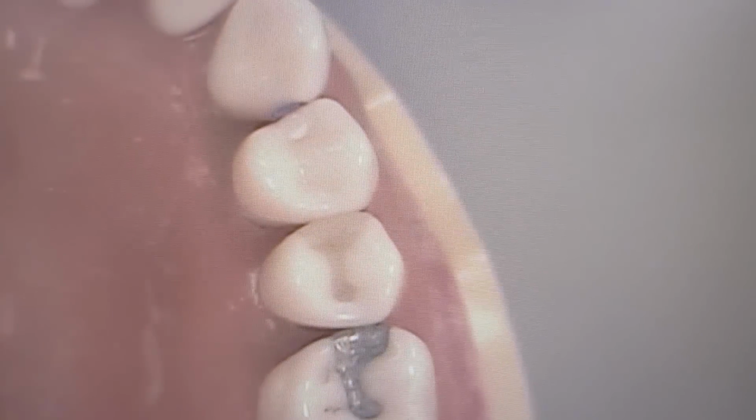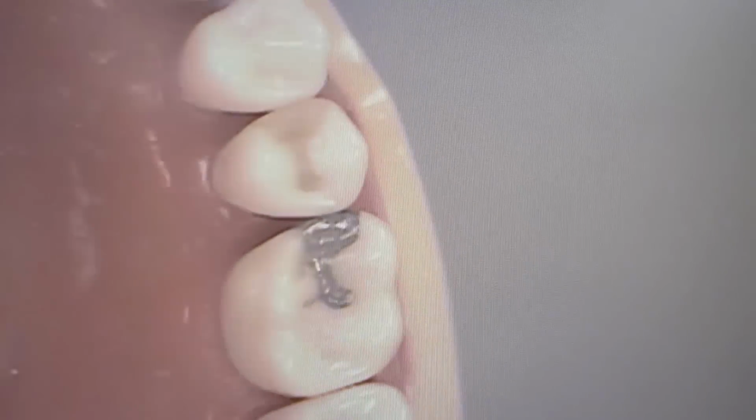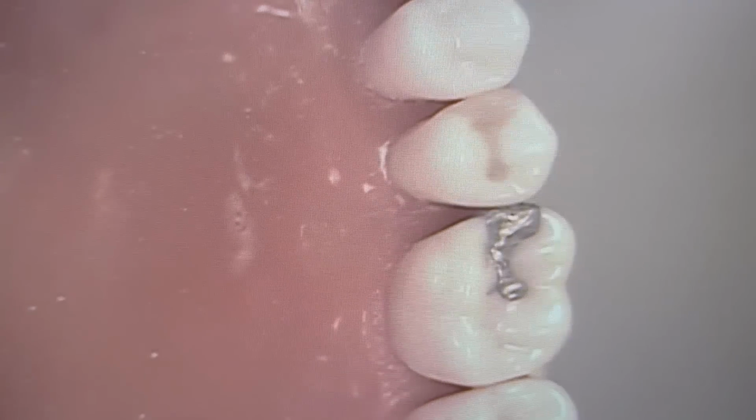Now you can finish it off with a white stone. I'll take a white stone and just go over the margins very, very lightly. I didn't use any bonding agent or wetting resin to get this nice smooth finish, right? So no bonding agent or wetting resin to get that smooth finish.